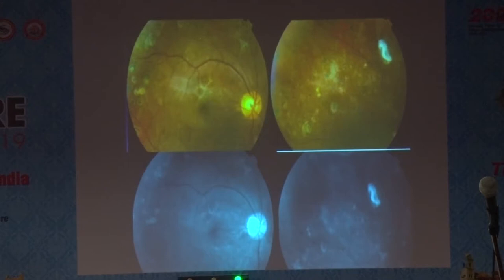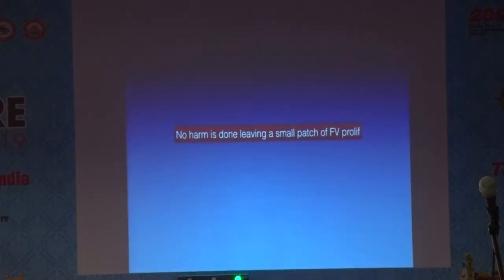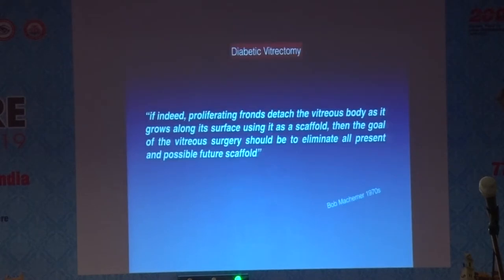Again, please don't get a wrong impression. In most cases, we are able to remove all the fibrovascular tissue. But in some situations, the bleeding happens and you are stuck. Before that, I have tried to remove it and it bleeds again, remove the clot, again it bleeds. So it's safe to leave behind as long as you have relieved all the traction.